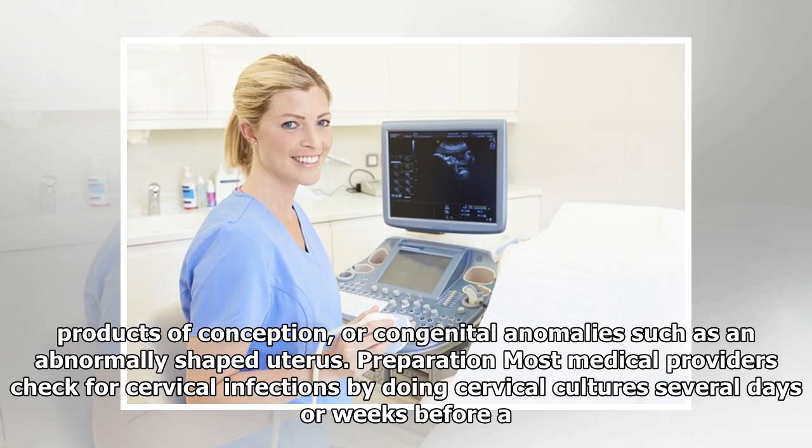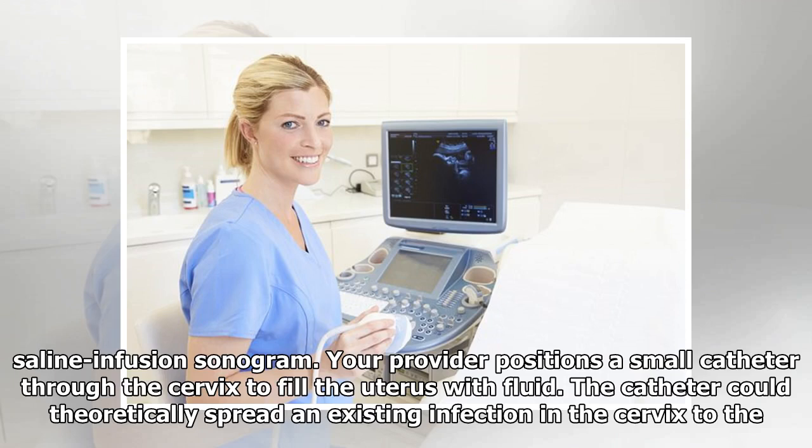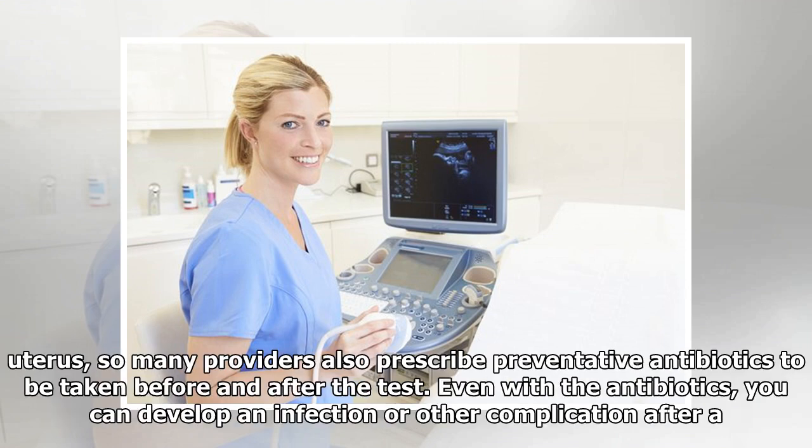Most medical providers check for cervical infections by doing cervical cultures several days or weeks before a saline infusion sonogram. Your provider positions a small catheter through the cervix to fill the uterus with fluid. The catheter could theoretically spread an existing infection in the cervix to the uterus.